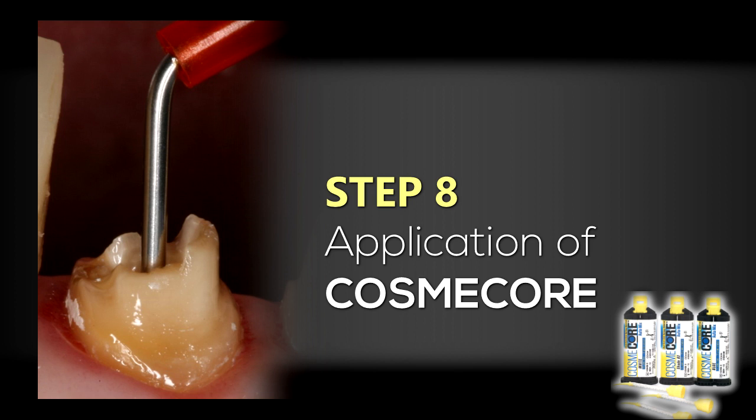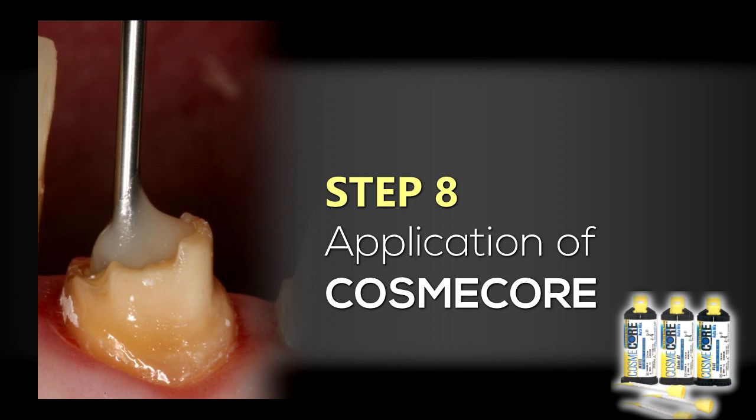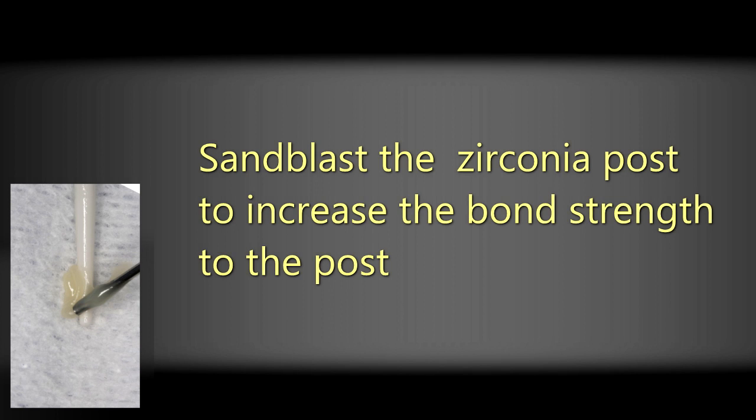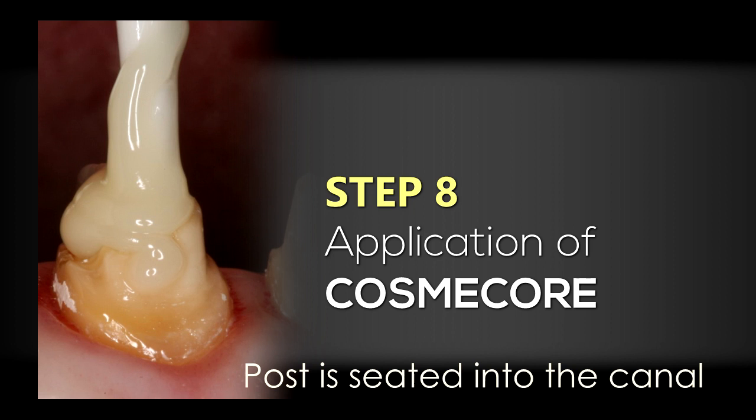Using needle nose tips from the Centric system, I'm going to inject the Cosmocore dual cure core buildup material — this is A2 Cosmocore — down into the post space, making sure to fill the internal aspect of the canal system. Then I place some Cosmocore onto the tip of the post. The post has been pre-treated with either Rocatec or Cojet to enhance the bond to the zirconia post. The Cosmocore is placed onto the post, and the post is seated into the canal system, making sure it goes all the way down to its full extent.